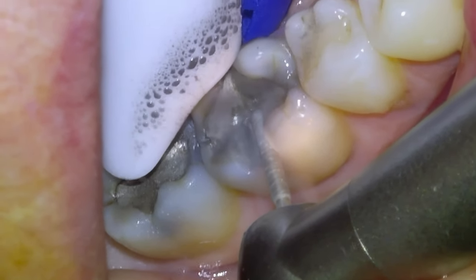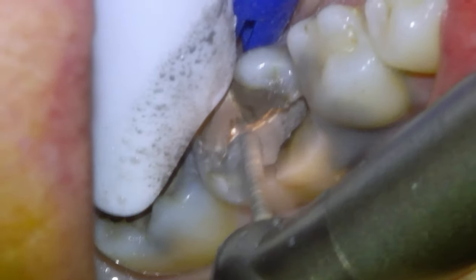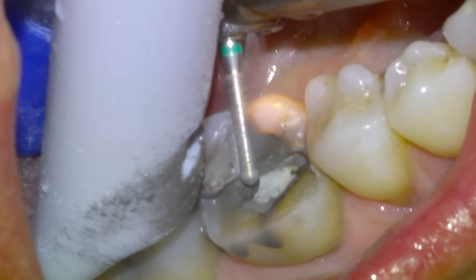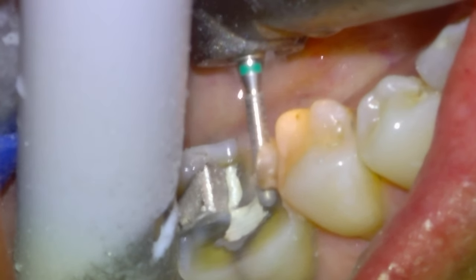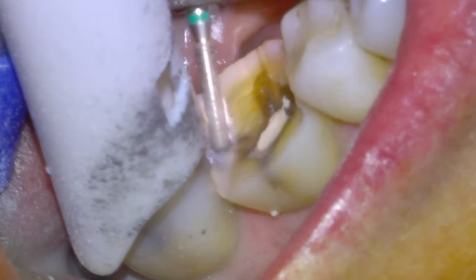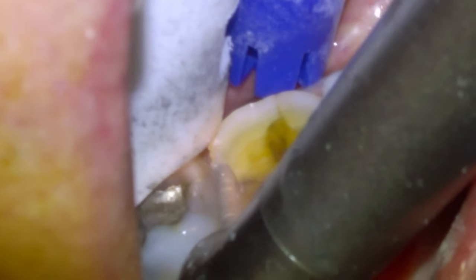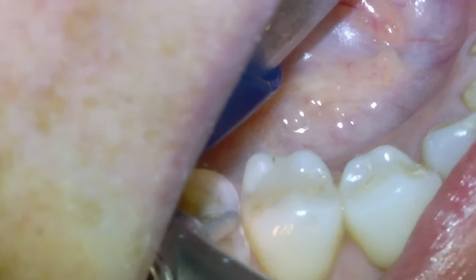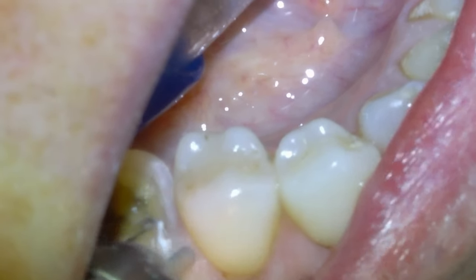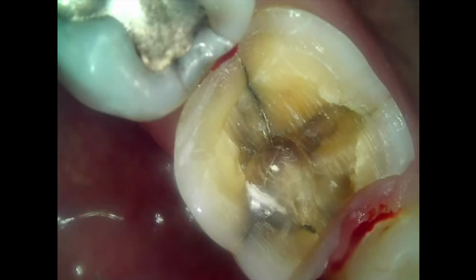Anytime I'm doing a crown and an endo together I'll take a couple millimeters off the occlusal surface just to get us that much closer to the orifice. We're going to use a KS1 to do our occlusal reduction, and then if we try to put a rubber dam on right now it's going to shred, so I'll open up the interproximal contacts and then we'll be good to get a rubber dam on. Sometimes I'll do the orifice discovery with the rubber dam off, but this one the access is pretty clear. There's the x-ray — you can see the crack there.